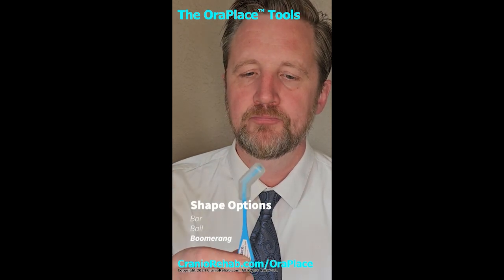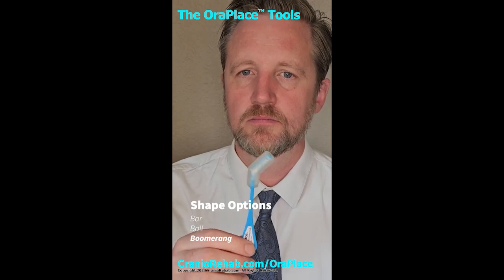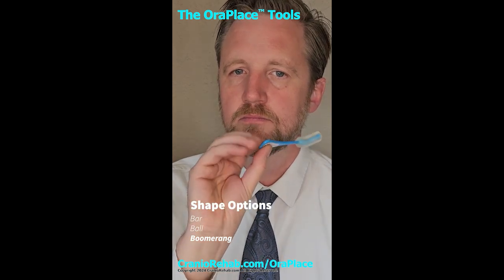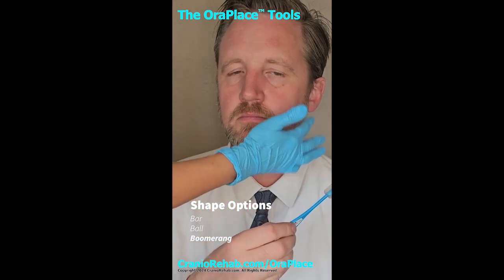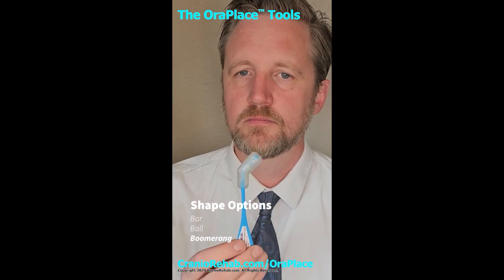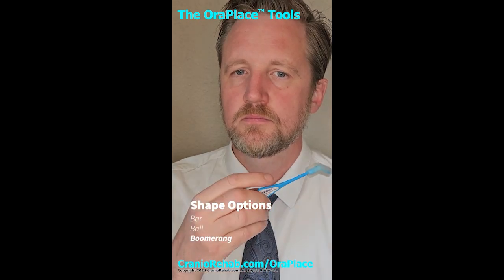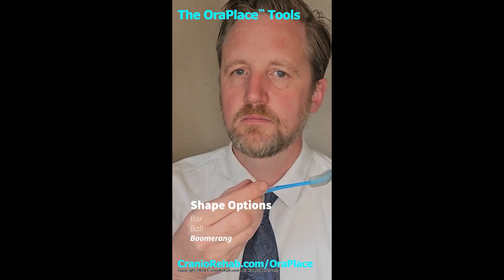Lastly, we will look at the boomerang shape. It is specifically angled to go along the bottom of the jawline, and it flips upwards to target the cheekbone area as well. So this area and up in here. For a more intense stretch, you can turn the bottom edge outwards. This one I like to twist as I put it in.